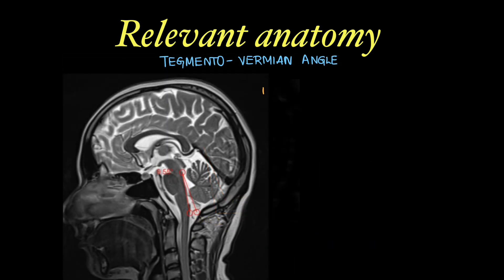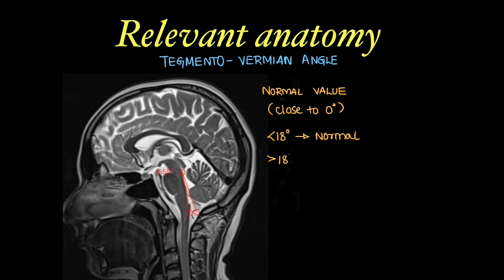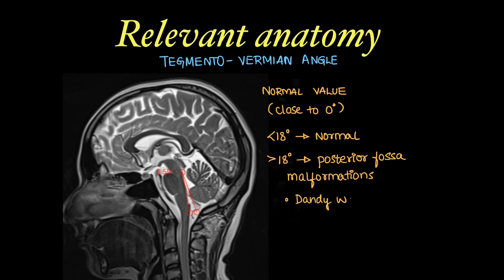The normal tegmento-vermian angle is supposed to be close to 0 degrees. In this image it is 9.55 degrees. The normal range is 0 to 18 degrees, and more than 18 degrees is seen in posterior fossa malformations like Dandy-Walker malformation.